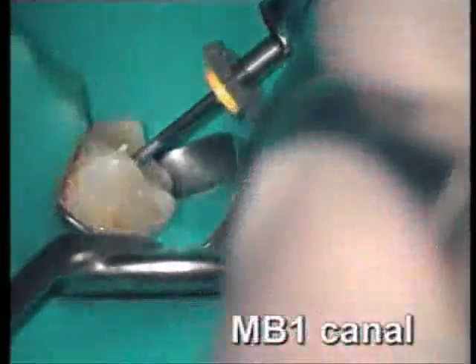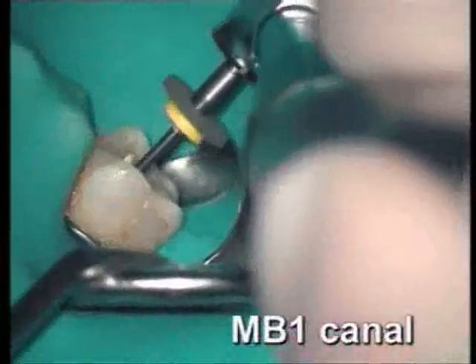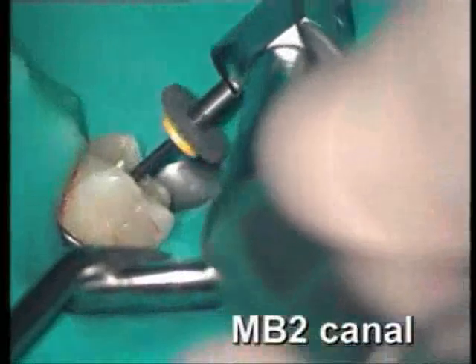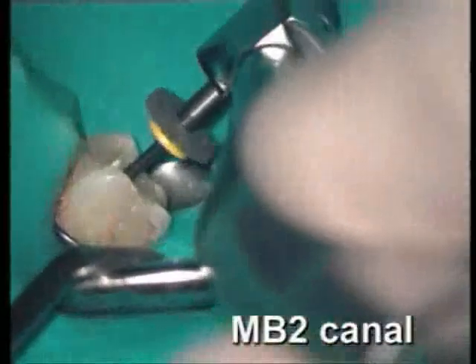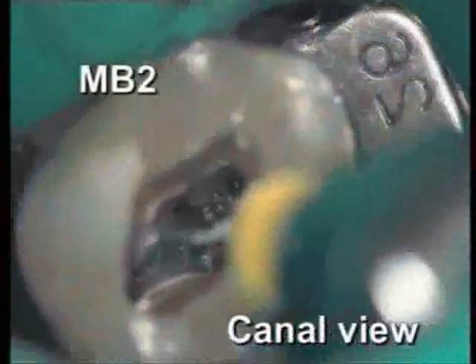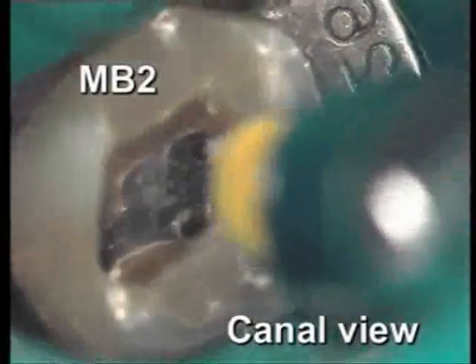Again a light hand and only few strokes in each canal. This is a canal view of a mesio-buccal canal and we see how the instrument effectively brings out debris from the canal.